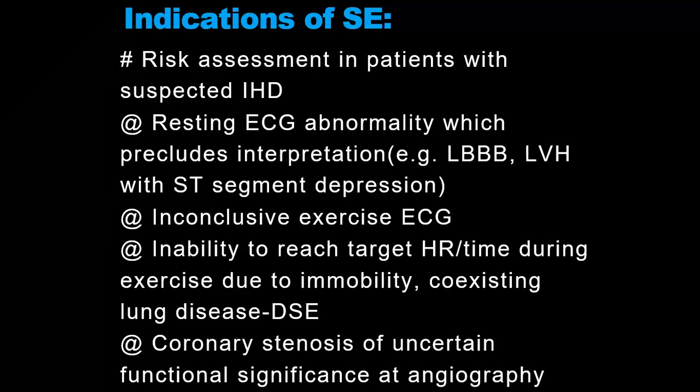Indications of stress echocardiography: risk assessment in patients with suspected IHD, resting ECG abnormality which precludes interpretation, like if there is LBBB, LVH with ST segment depression, inconclusive exercise ECG, inability to reach target heart rate during exercise due to immobility, coexisting lung disease. In this case, dobutamine stress echo is best.